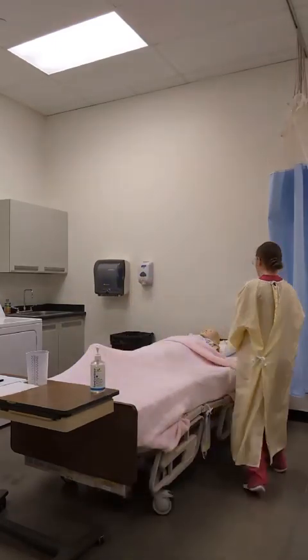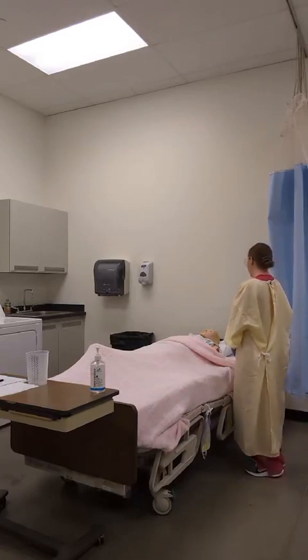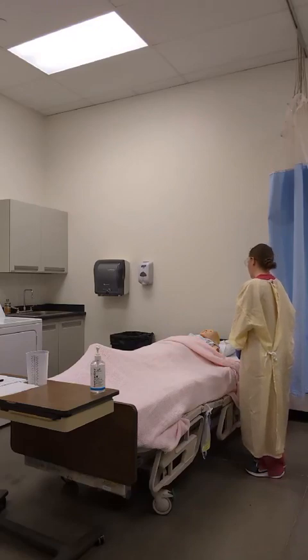Good morning, Mrs. Brown. My name is Mackenzie and I'm going to be your STNA today. I'm here to empty your urinary drainage bag, but I just need to gather some supplies. I'll be right back.